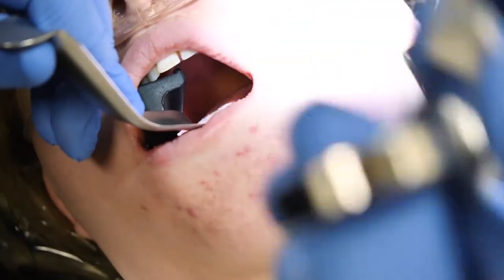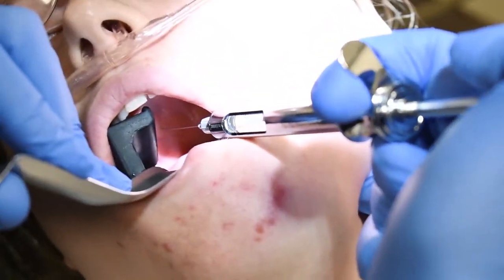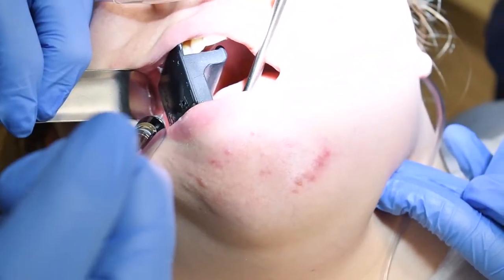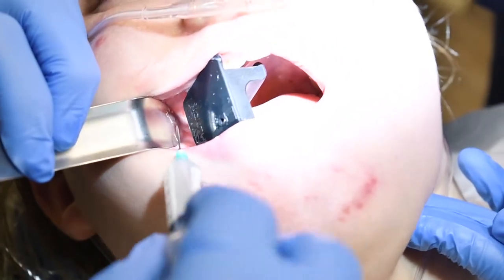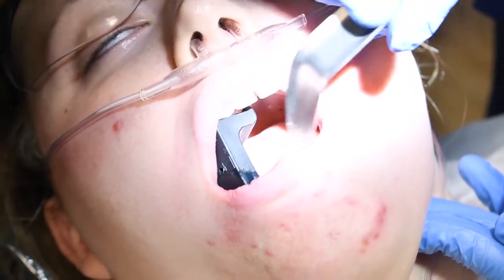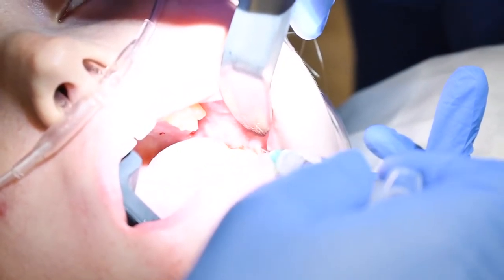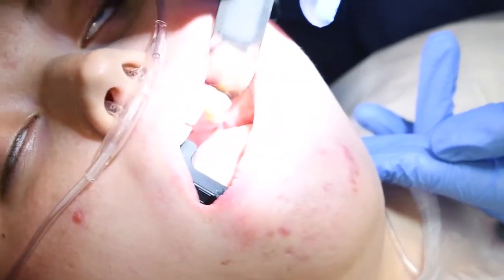Aspirating, making sure we're not in blood vessels. Then we'll get the top numb — a little puddle injection right there, a little infiltration over here, and then we'll get the Exparel. A little local anesthetic right in this area, and then back over here, and for the top one as well. That's it for the Exparel.